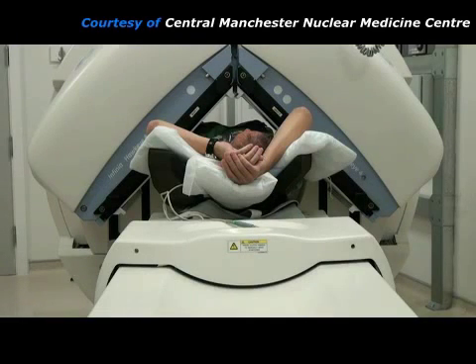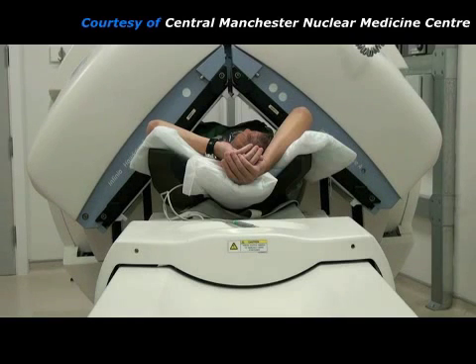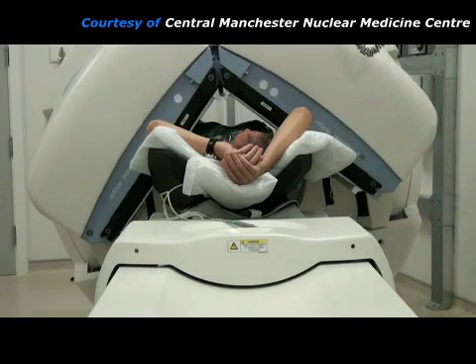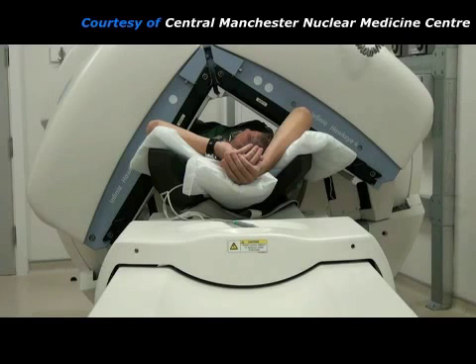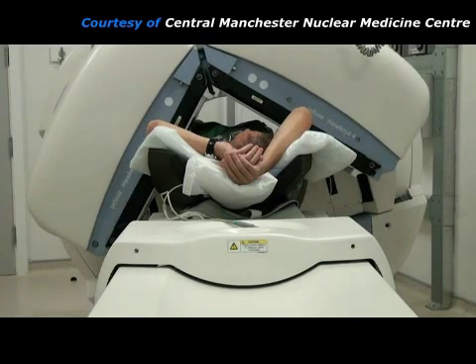The gamma camera takes a pair of pictures with its two detectors, then moves a bit and takes another pair of pictures. This is known as SPECT, which stands for Single Photon Emission Computed Tomography. This series of pictures will allow a computer to reconstruct cross-sectional images through the heart, showing blood flow to the heart muscle, the myocardium.